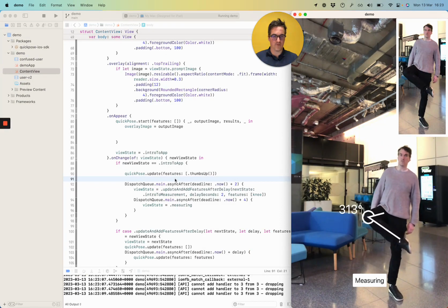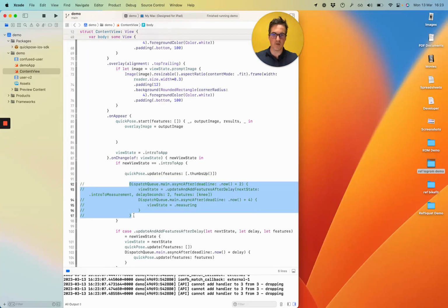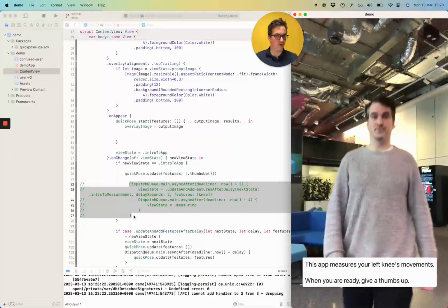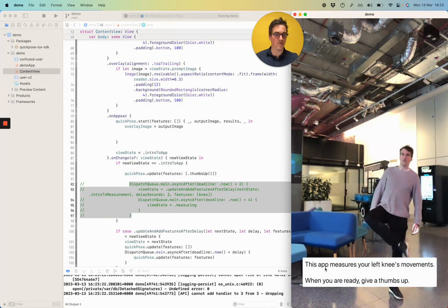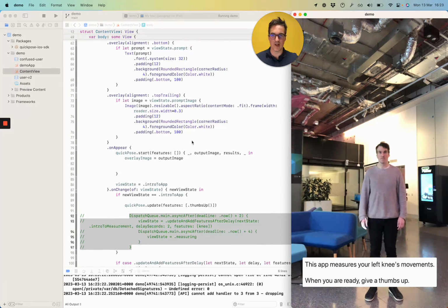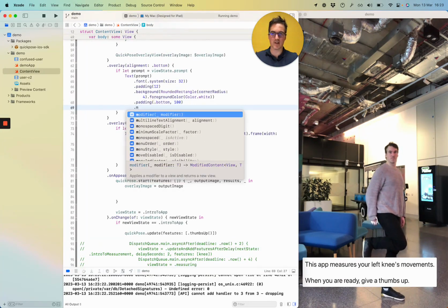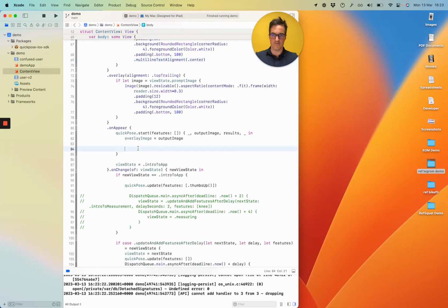Cool. Well, it's very quickly getting overwritten, so I'm just going to block out that code for now. In fact, I didn't even see it working. Oh, there we go. So my thumb is highlighted here. That's the thumbs up detector in action. Because this is a kind of production ready application, I'm just going to tidy up the layout there. So we want the text alignment to be centered. Okay, let's give that a go.